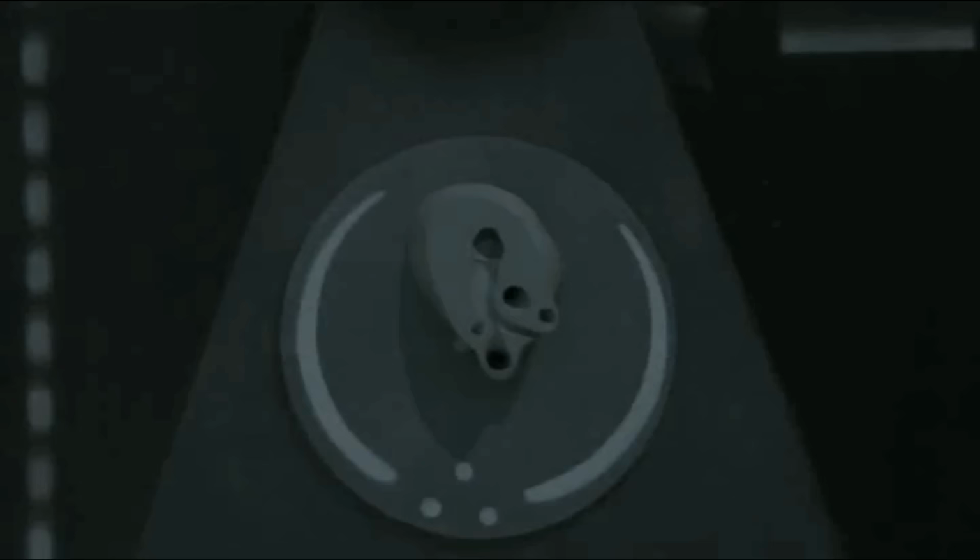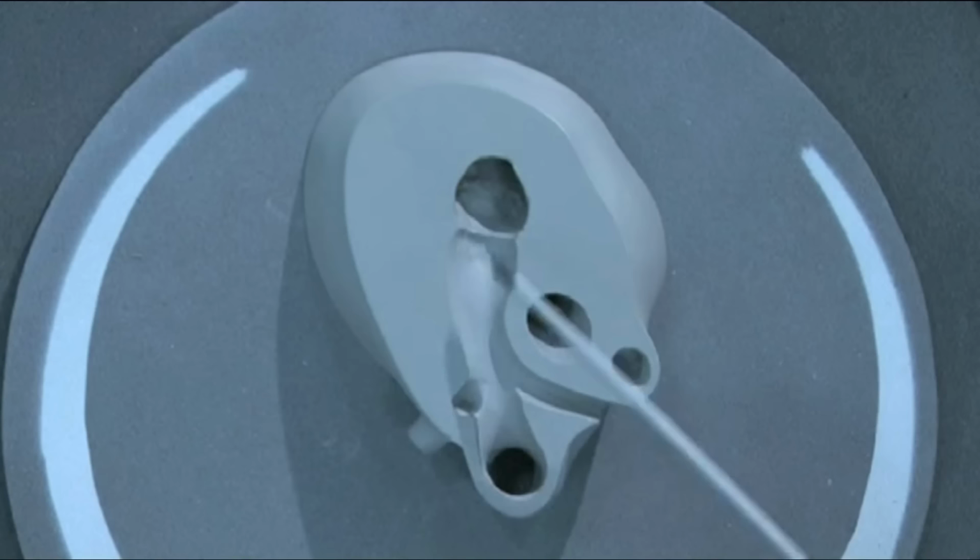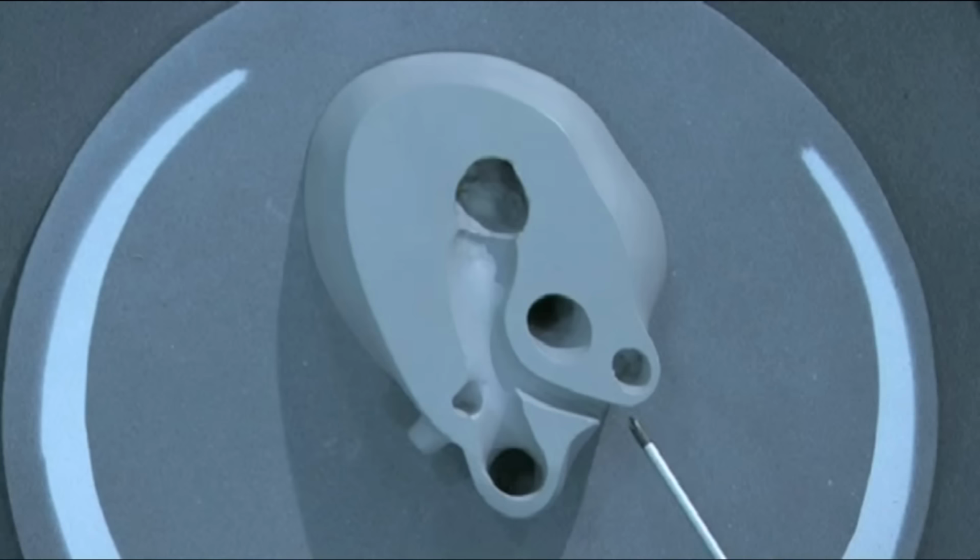When the baby's lying on its back like this, the aortic outflow will be easy to see, but the pulmonary outflow and the duct will be difficult because they're running in the same direction as the scan beams. However, this will allow the right branch of the pulmonary to be seen much more clearly, so you need to move your probe around the patient to orientate onto the baby to try and demonstrate the right branch.